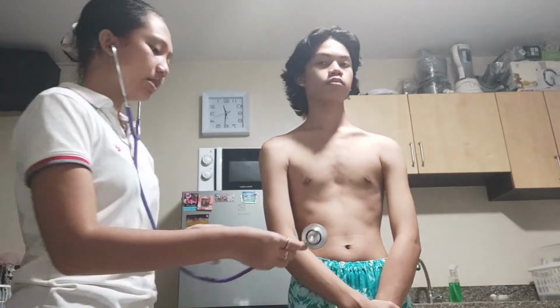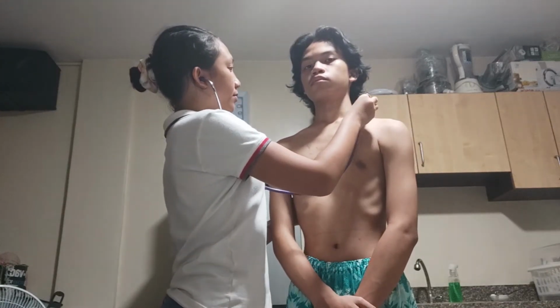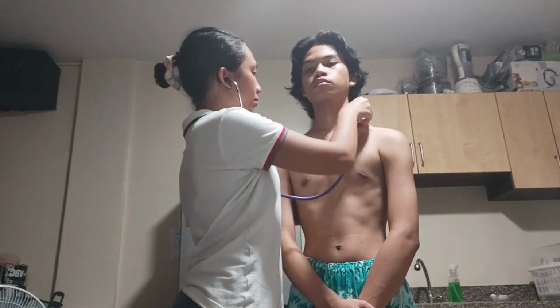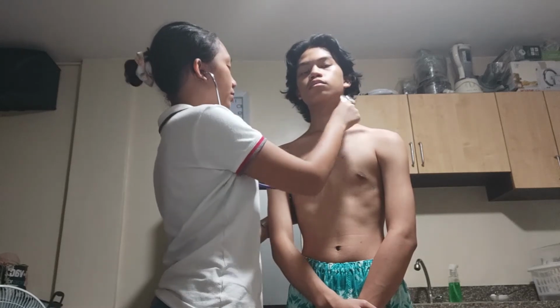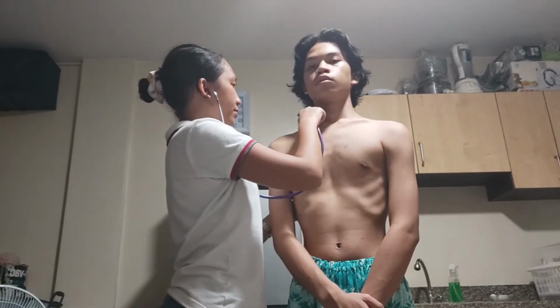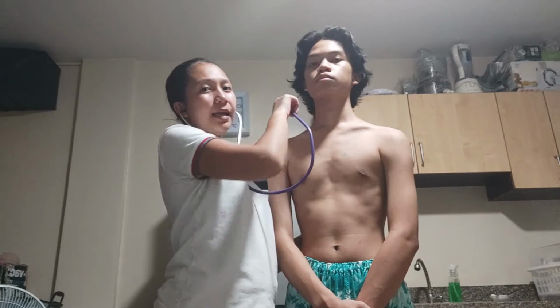Okay. Let the patient breathe in and breathe out and inspect the apex. Okay, breathe in and breathe out. Breathe in, breathe out. And then after the apex, we're going to the second intercostal space. This part helps us to assess the right and left upper lobe.